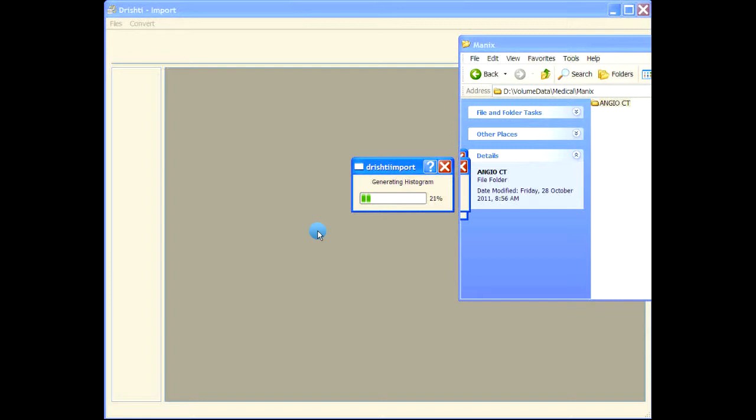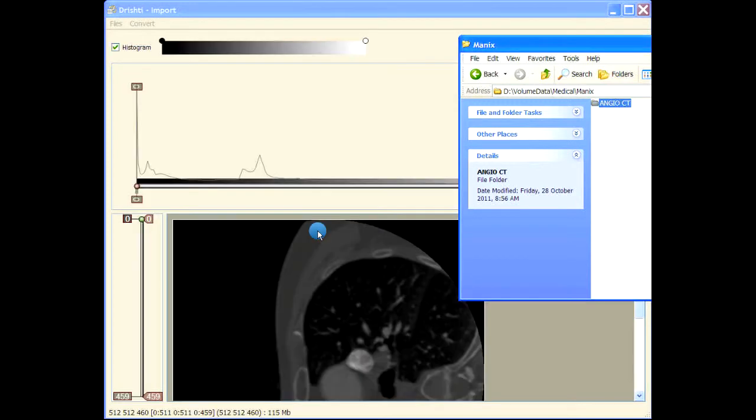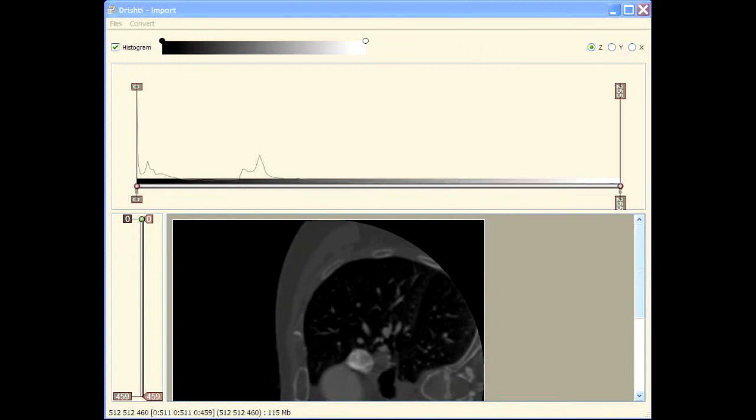If you have serial numbers for the images, then users can easily sort the images using the directory sort function and then load the directory. Users can also select a range of images and then load those images instead of loading the entire directory.